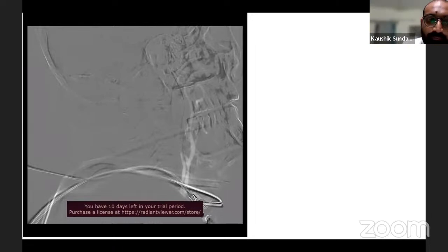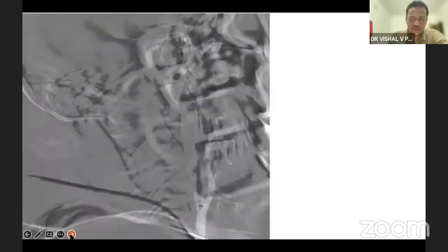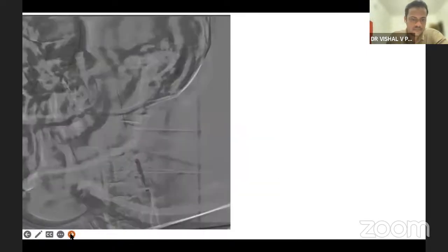Now tell me, with this, what I am seeing is that this was probably a stenotic segment where you were able to navigate through the thrombotic area. That is what it tells me. I said, okay, now I know what it is. It has gone through that. It is probably a chronic stenosis. Then you did a balloon, 3/7/5. Okay, next. Balloon. Okay, you did an angioplasty.